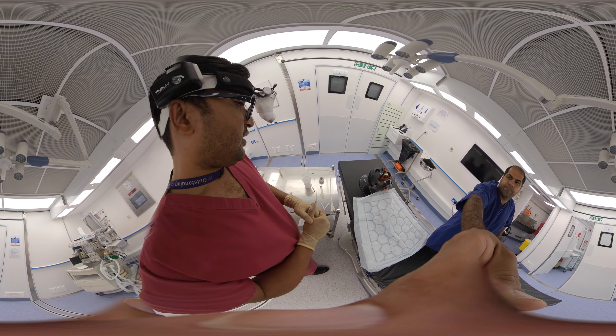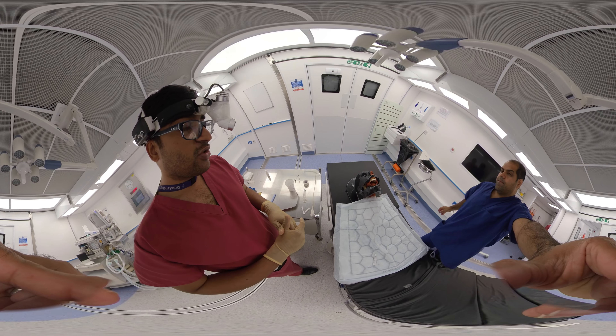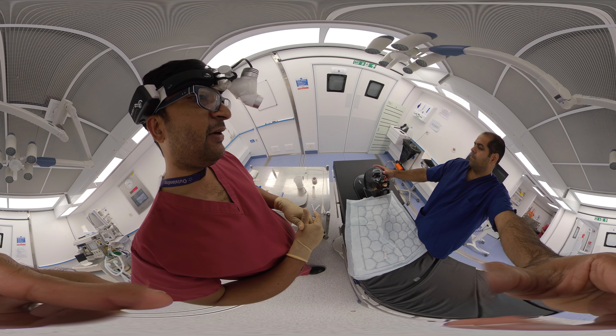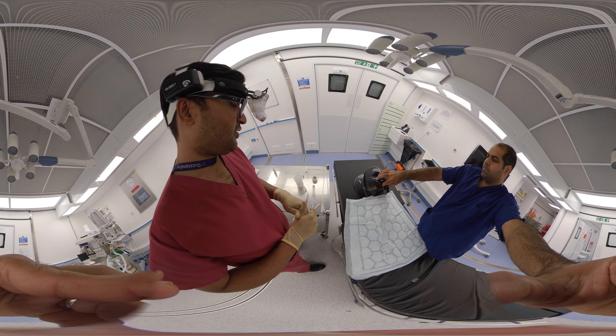This procedure should be done only if the bleeding is not controlled even after anterior nasal packing, or if there is any suspicion of a post-nasal bleed. After getting consent from the patient, we proceed.